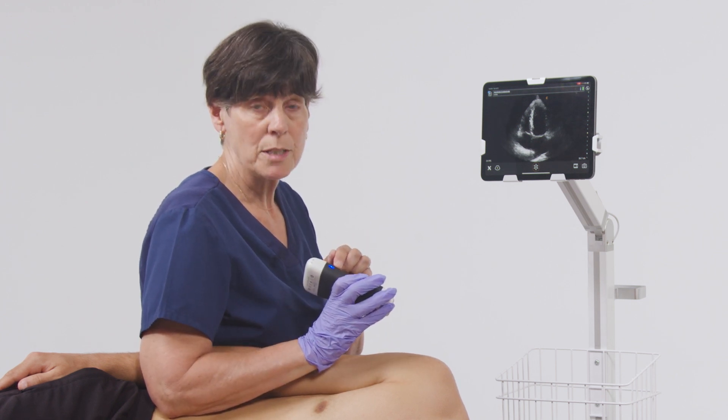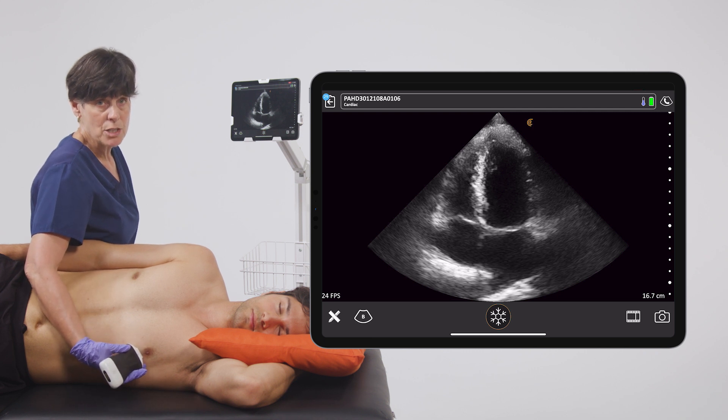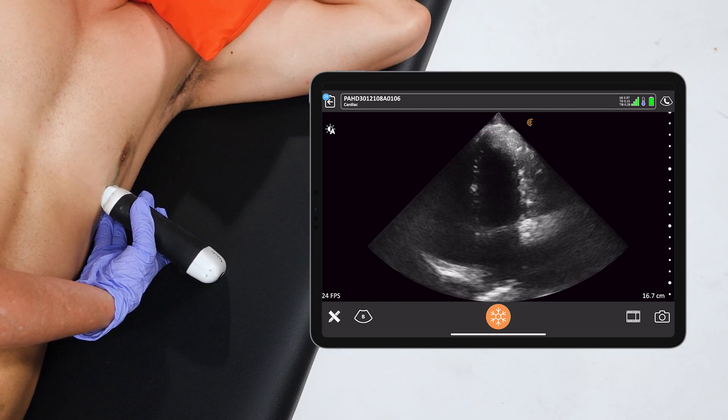We'll have the indicator pointed toward the patient's left and I'm going to place the scanner in the region of the cardiac apex. From here we'll just move the scanner slightly to find the right rib space.